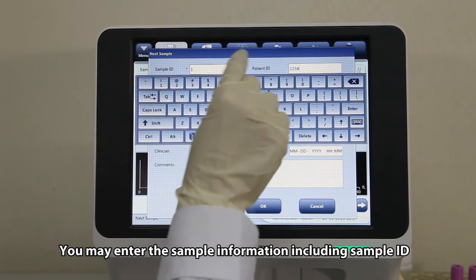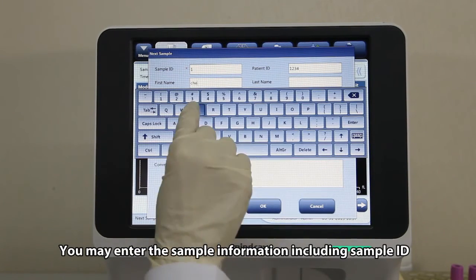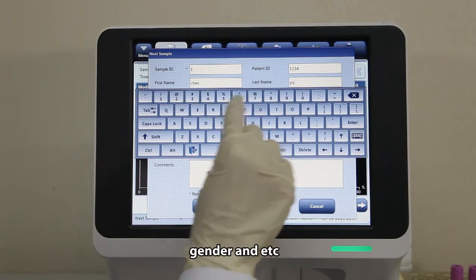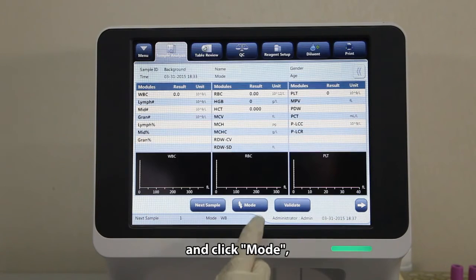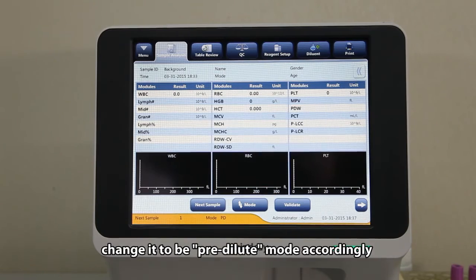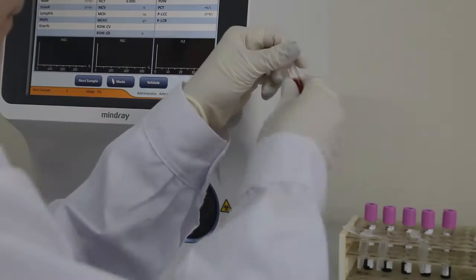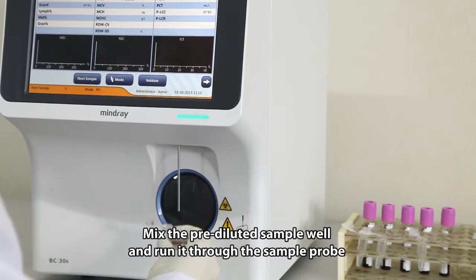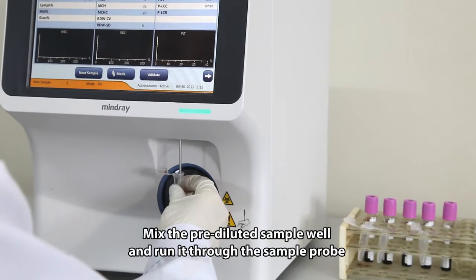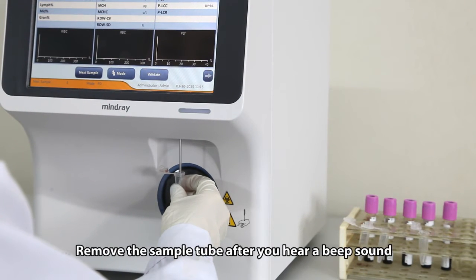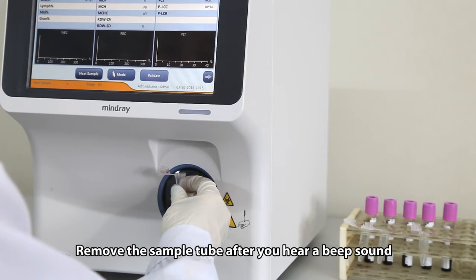You may enter the sample information including sample ID, name, age, gender, and click mode. Change it to pre-dilute mode accordingly. Mix the pre-diluted sample well and run it through the sample probe. Remove the sample tube after you hear a beep sound.